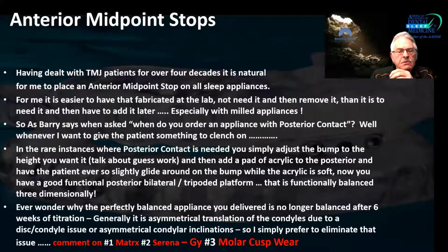But once I began noticing this, I have noticed that many of the patients that have developed anterior open bites with an NTI, not with a sleep appliance, but with an NTI, have had this molar wear configuration.